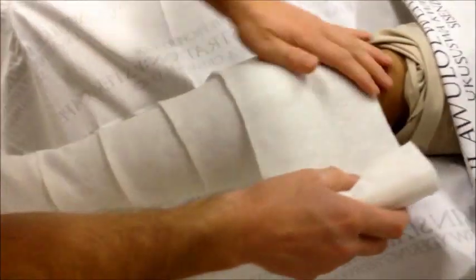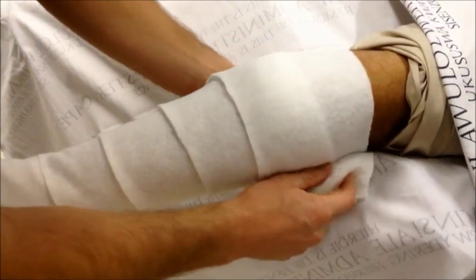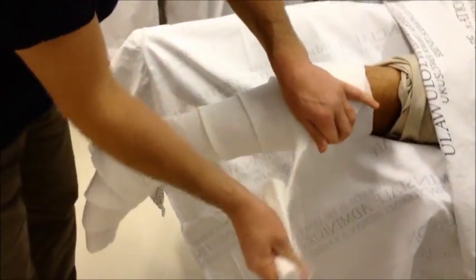We're going to go up all the way to the popliteal crease and then either tear or cut the residual tape off.